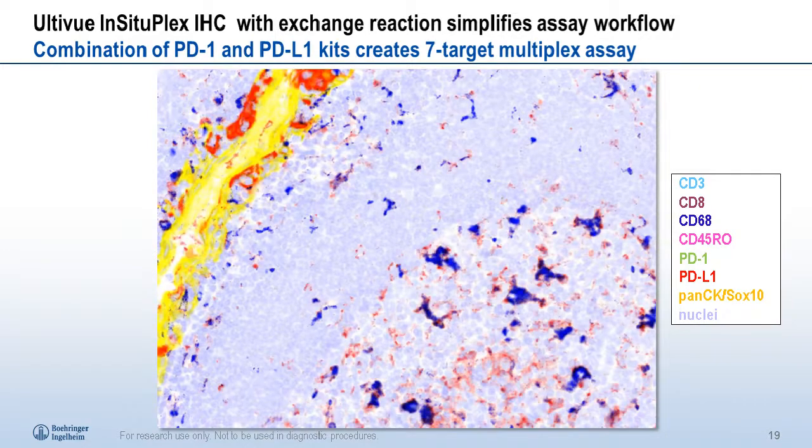Both of these cell types can co-express PD-L1. You can see there's some really robust PD-L1 in the epithelium up in the top left, and a much more moderate PD-L1 in the phagocytes, particularly in the germinal center. And you can see it's a very membrane-localized signal.